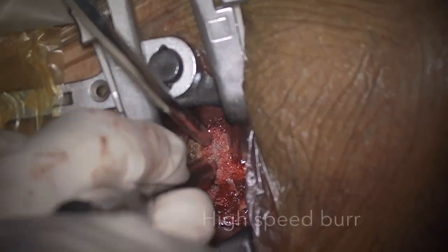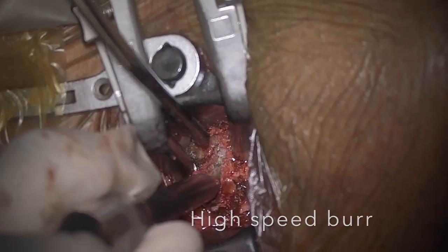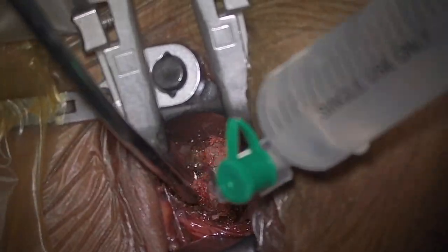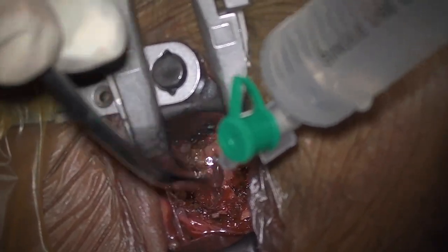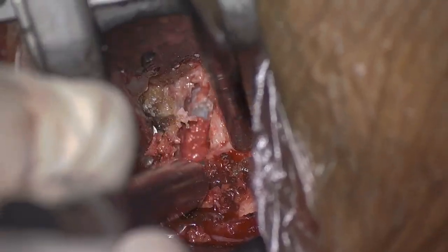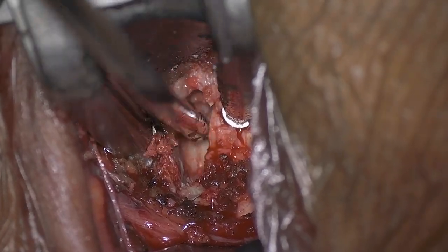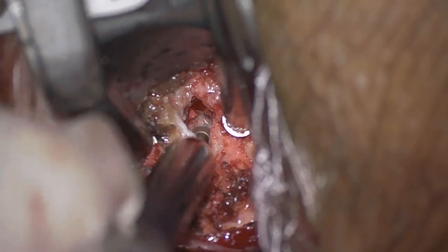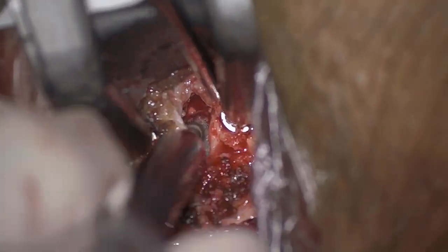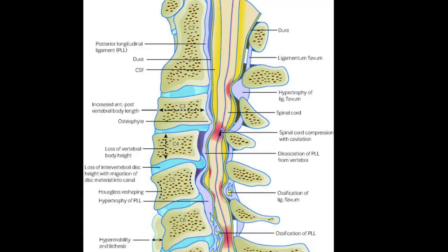This will make it easy to access the disc space, which is narrow in this case. Once you have distracted the disc space, high-speed burrs can be used to burr out the collapsed disc. It is important to continuously irrigate while using the high-speed burr, as it prevents thermal injury and removes any debris produced by the burring.